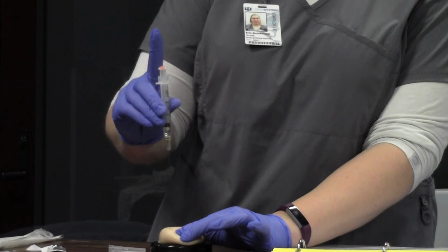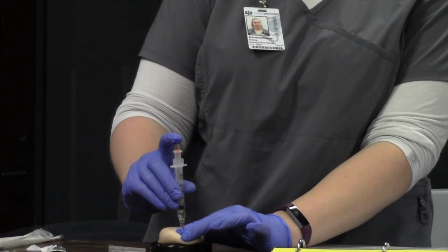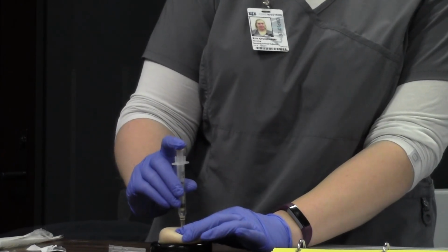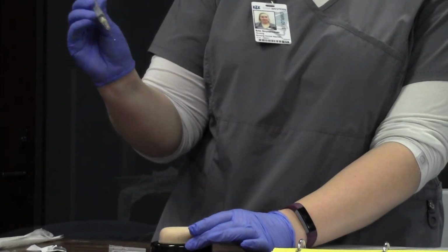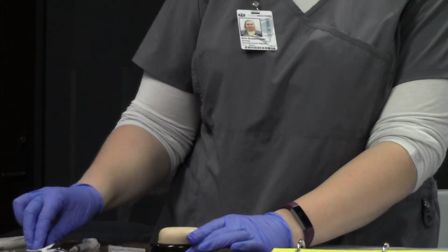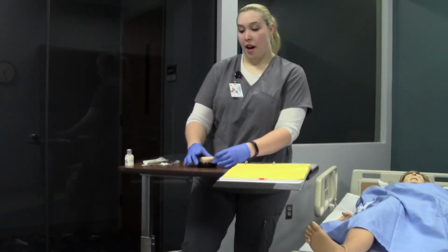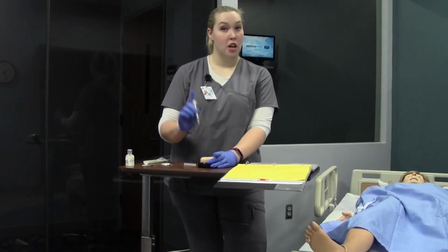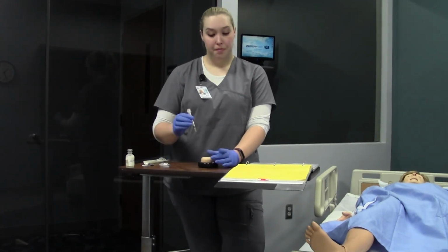and I'm going to go straight in at a 90-degree angle, and you're going in like a dart. Straight in, let your patient know what you're doing before. So on the count of 3, I'm going to inject your medication. And then I'm going to go ahead and give the medication, release, and pull the needle out and activate my safety. I'll blot if there's any blood, and I can put a Band-Aid there if needed. You need to make sure you're going to go in like a dart. Don't go in slow. It's not very nice to your patients.